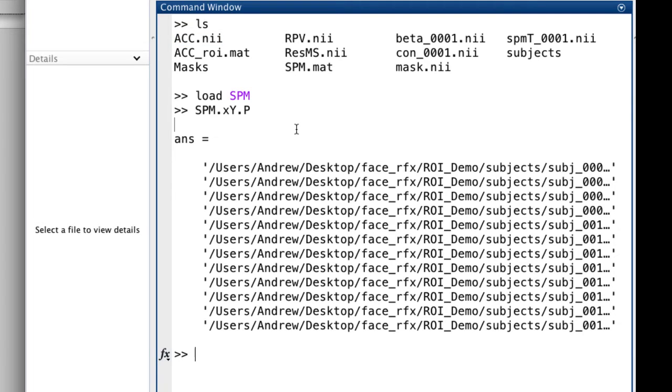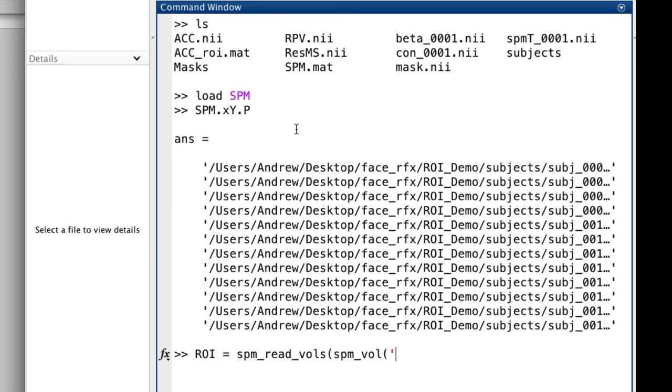We'll be using both the ROI and those paths to the contrast images to carry out our ROI analysis. The rest of these commands I'm typing out can be found in the blog in the link down below.